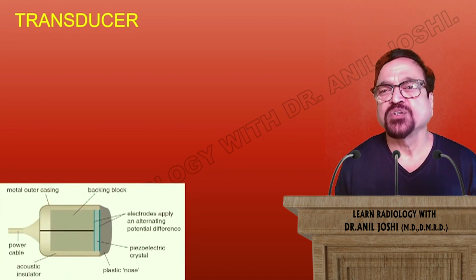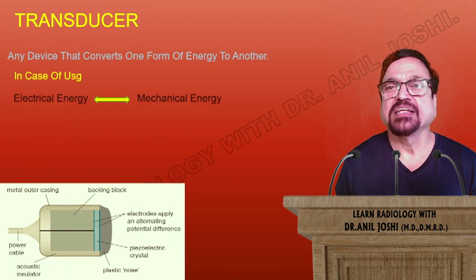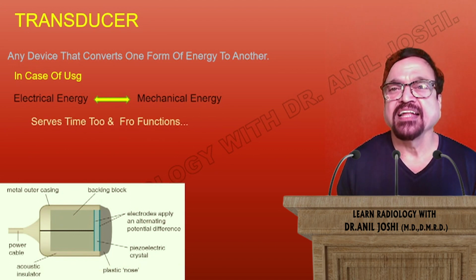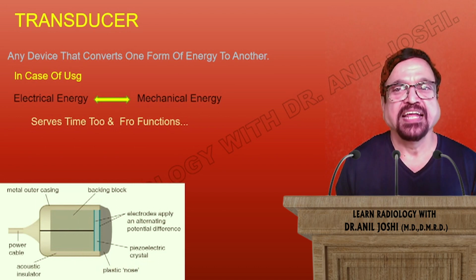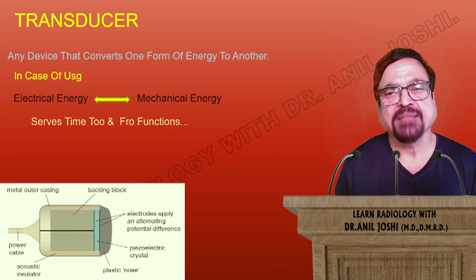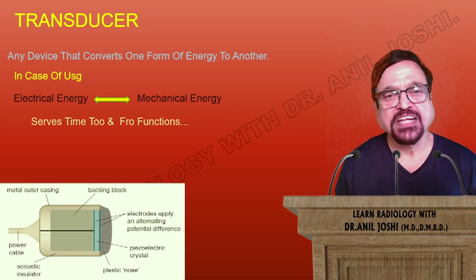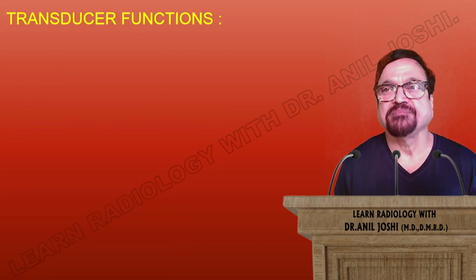Now, this is the transducer. It converts electric energy into mechanical energy and serves the same function the opposite way. When the electric supply is applied to the piezoelectric crystal, it vibrates. It gives ultrasound. When it receives ultrasound, that sets it into vibration and a signal is produced.